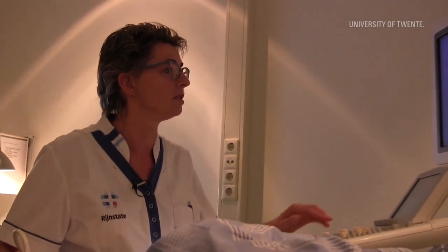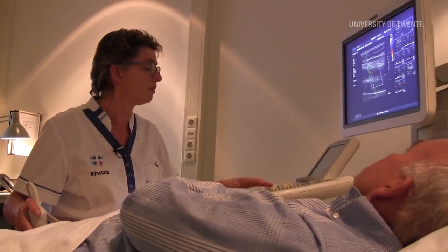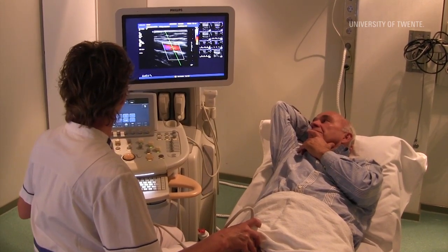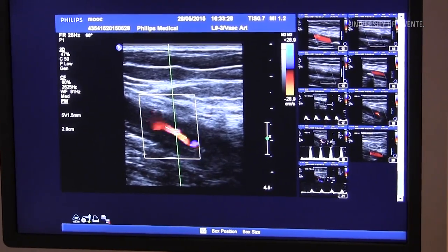Secondly, we should choose the specific direction in which we want to hear the Doppler effect with our probe. Assume that we can hold the probe perpendicular to the skin and vessel and that we can electronically listen in various directions. Our next question is, what is the best direction for listening with respect to the blood vessel?